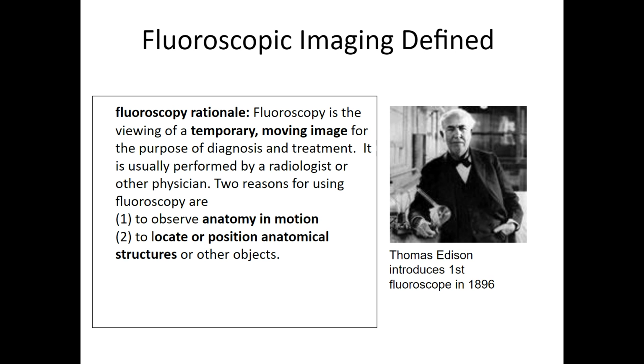And it's been around for a while, and I don't know if you know this, you think of this guy as the light bulb, right? But Thomas Edison created the fluoroscope. And as mentioned, the idea here is we get to observe anatomy that's in motion, and it can help locate anatomical structures. It's used in the OR, as mentioned, to see where they just put a screw or make adjustments if they need to. So it's really a good tool, although it is heavy on the radiation dose, right? So that is a downside.